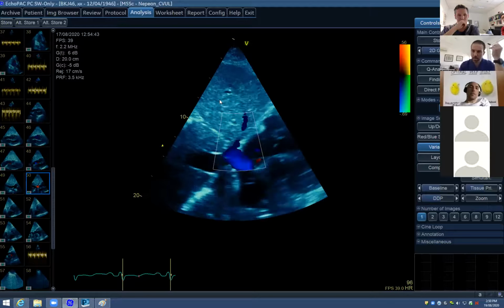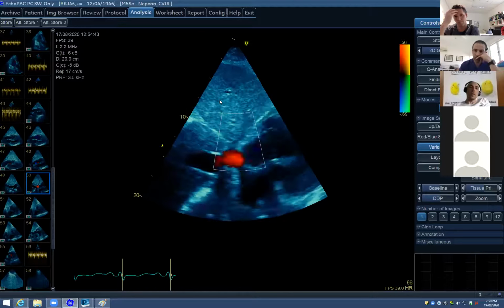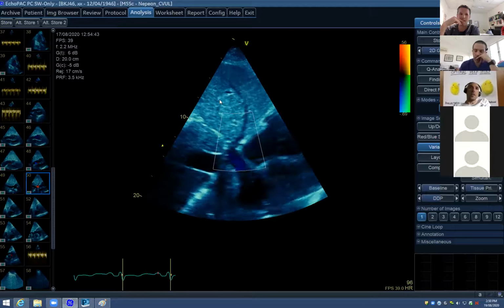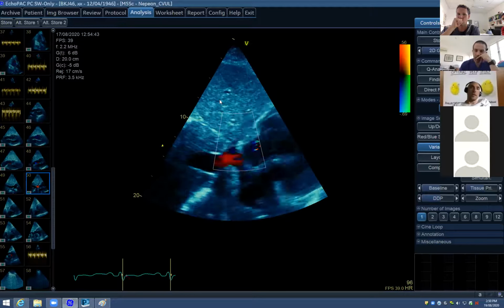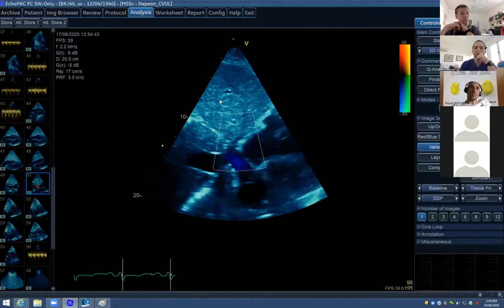There's a couple of different ways you can diagnose acute cor pulmonale. The way that I'm most familiar with in the literature is looking at the relative RV dimensions, looking at the relative size compared to the left ventricle, and ratioing it. So big RV and poor RV function.